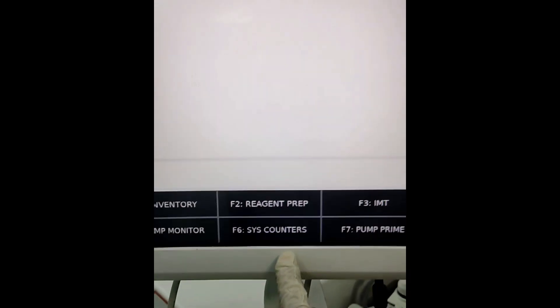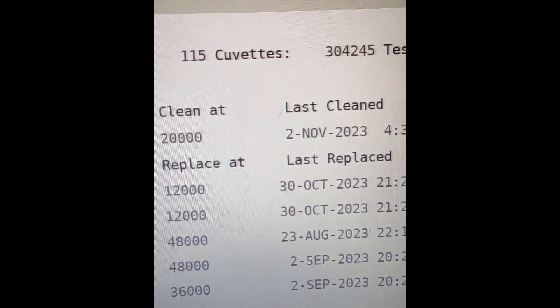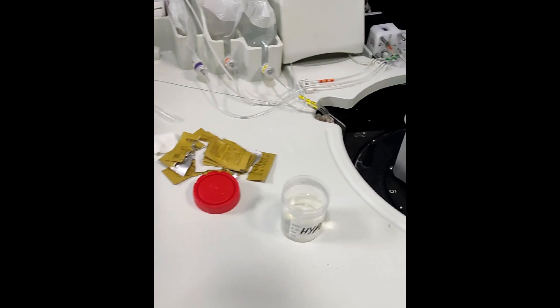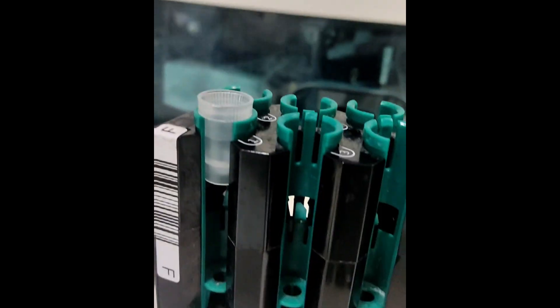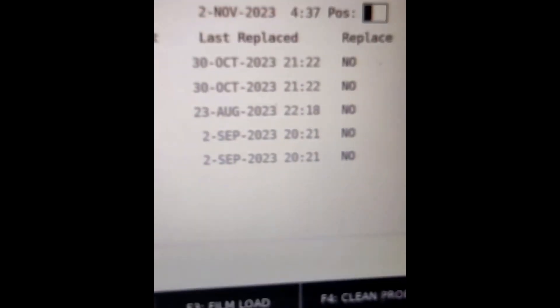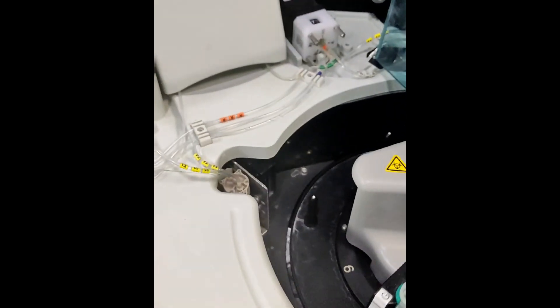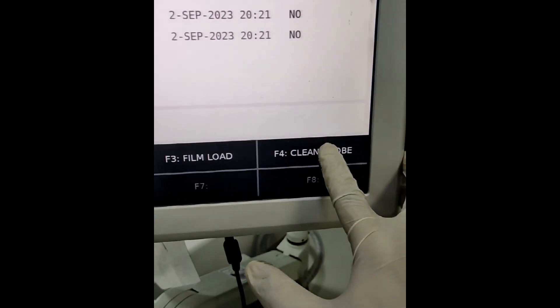We go to System Counter for sample probe cleaning. We again pipette around 1 ml of hypochlorite solution into a sample cup on a loaded tray and assign the position F1. We click on Clean Probe, which will take 5 minutes for internal cleaning.